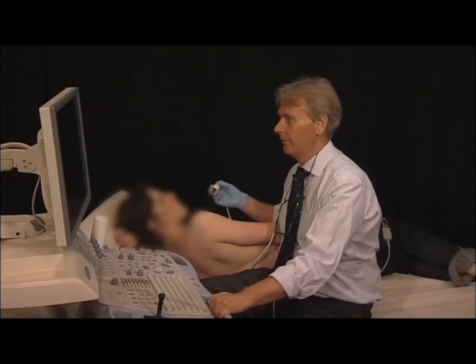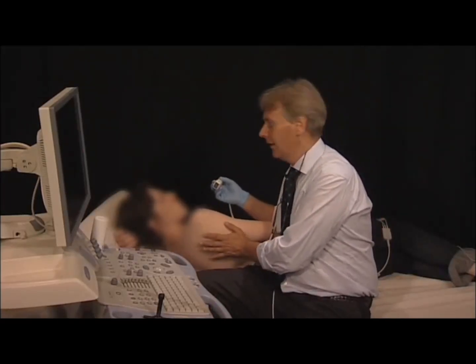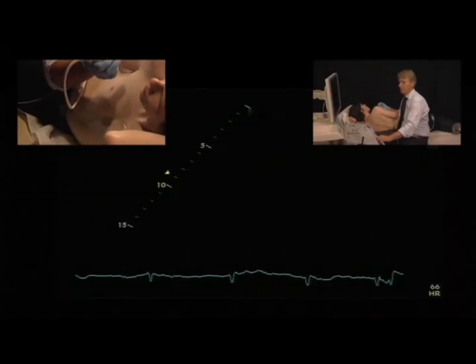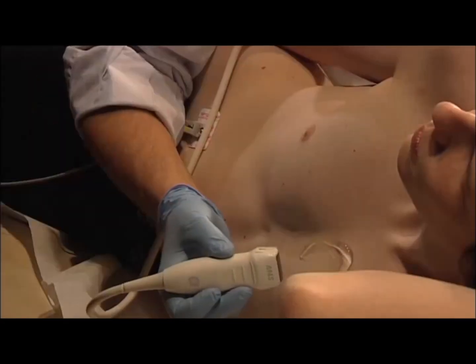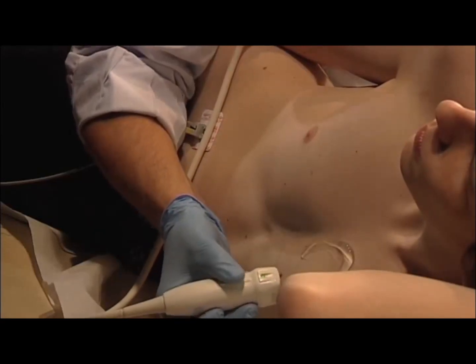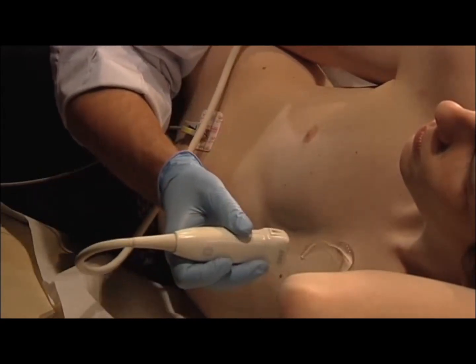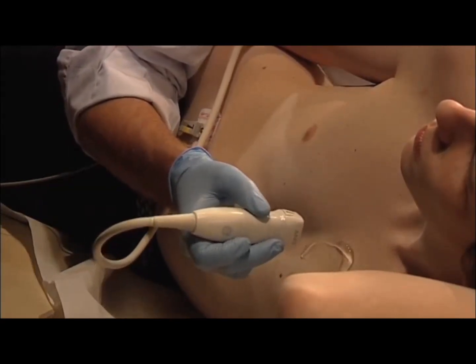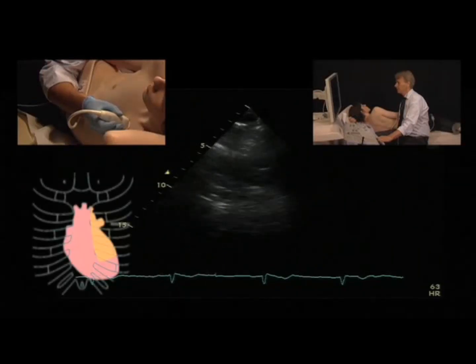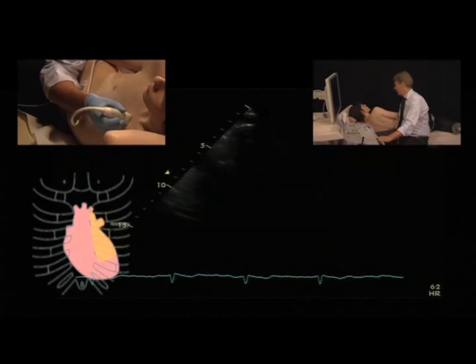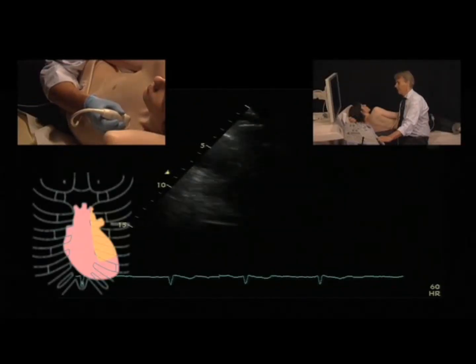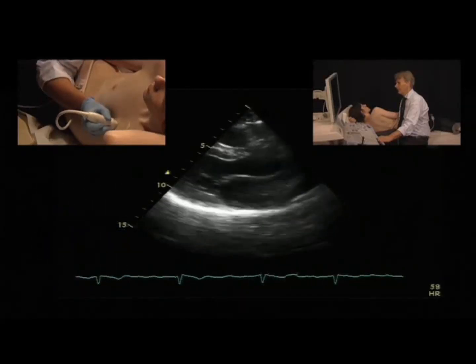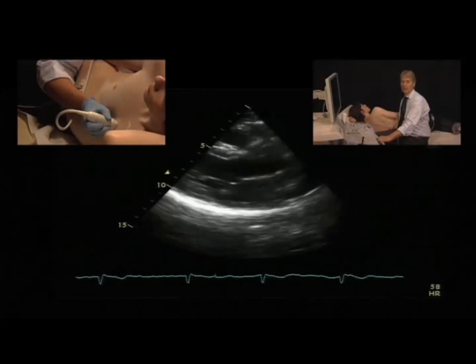How do we find the parasternal window? The patient is in a left lateral position — we try to bring him over as far as possible. Then we take the transducer and we have the thumb on the marker, oriented towards the right shoulder. We put the transducer on the chest, try to be as close as possible to the sternum, and then move downwards from one intercostal space to the next, and we immediately see where the window is.